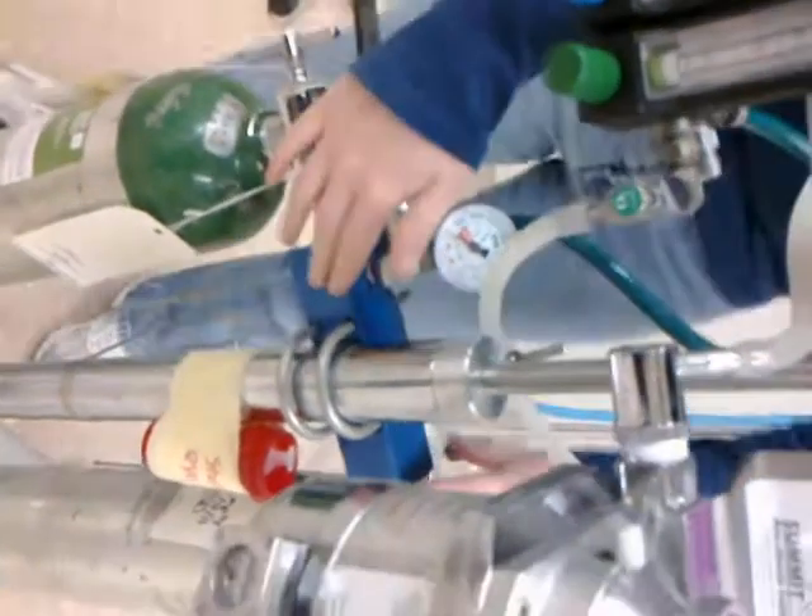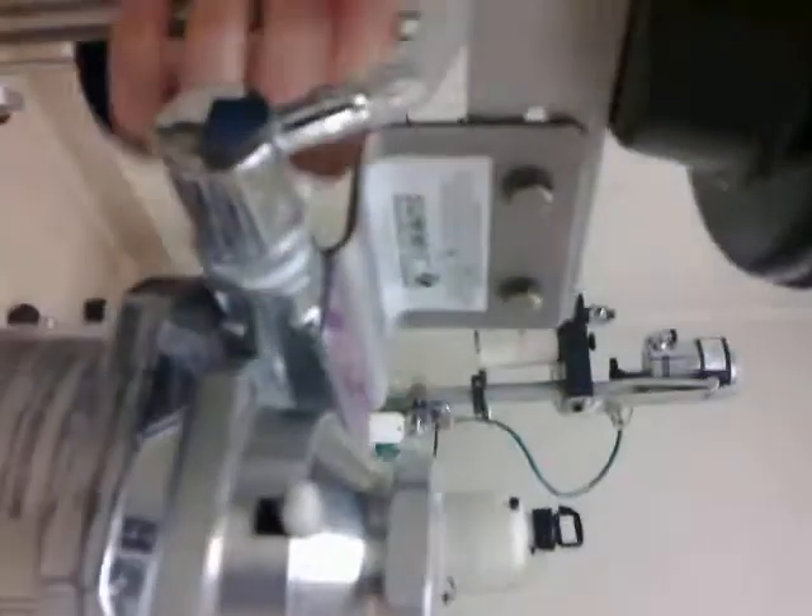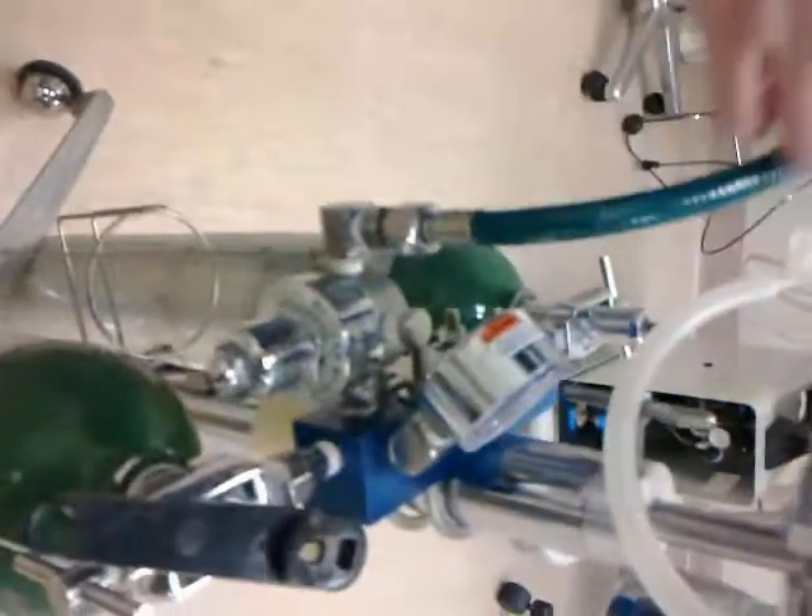We follow the gas line up, and it goes up into here, all the way through the tube here into the flow meter in the front.